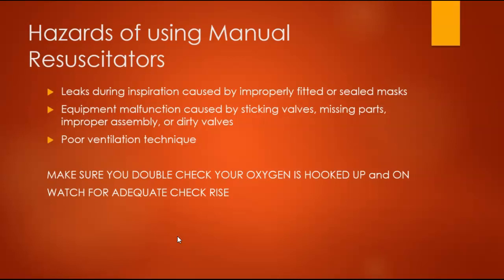If you let a bunch of gunk and grossness from the patient get into your bag, you should throw it out after the code is complete, because if it's allowed to stay there and dry, those valves definitely aren't going to work properly. Big thing with these two is just always, always, always double check your oxygen. This will happen to you as well.